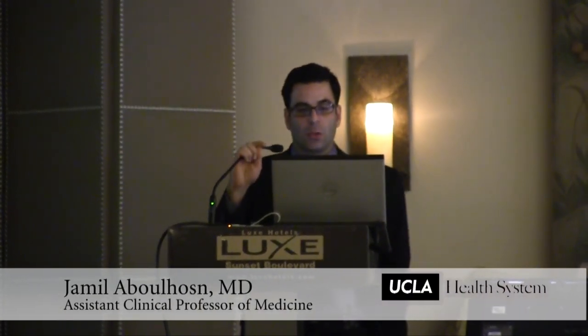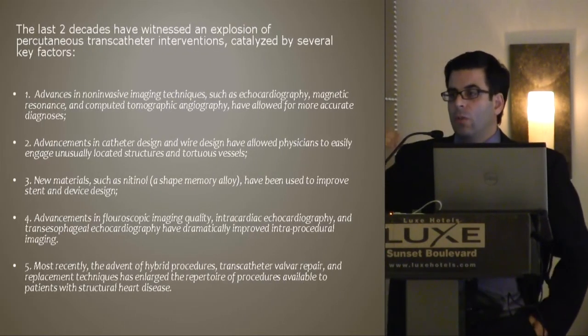So the last 2 decades have really witnessed an absolute explosion of transcatheter interventions, and they've been catalyzed by several key factors. Number one, and we've seen abundantly in this session, advances in non-invasive imaging techniques. Echo, MRI, CT, I mean, those were just unbelievable pictures. There really is an imaging revolution. And the imaging revolution is coming into the cath lab as well. So number one, advances in non-invasive imaging. We know what we're looking at.